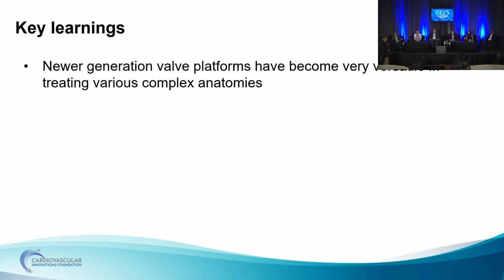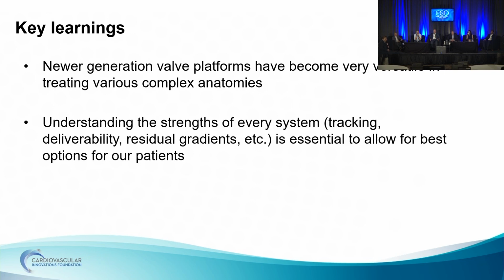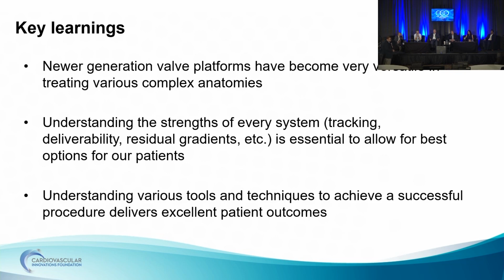So key learnings: newer generation valve platforms have become very versatile in treating various complex anatomies. Understanding the strengths of every system, tracking deliverability and residual gradients is essential to allow for the best options for our patients. And understanding various tools and techniques to achieve a successful procedure delivers excellent patient outcomes. Thank you very much.